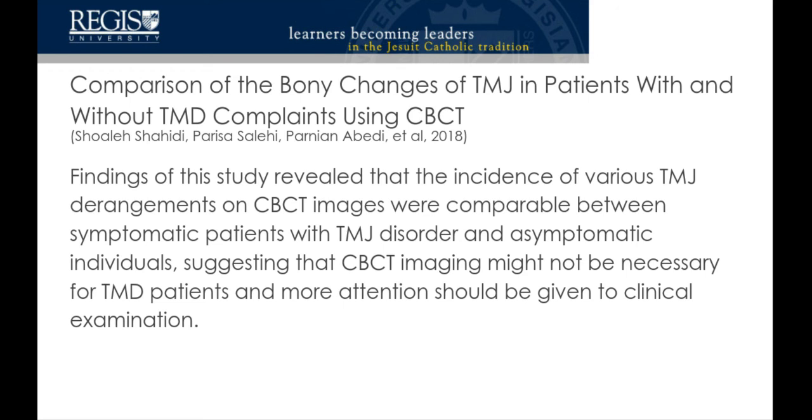Okay, well, I hope that was informative, and I hope that jives with what you already know about imaging in the spine. But not to say that these images aren't any good, it's just you need to take them and make them part of your assessment and not the definitive piece of information that drives your treatment.